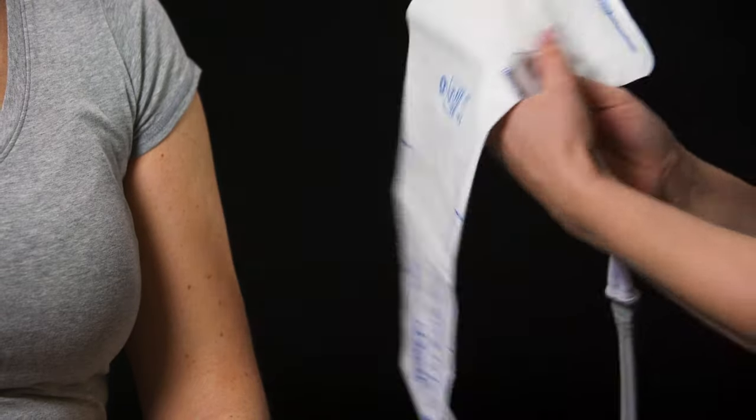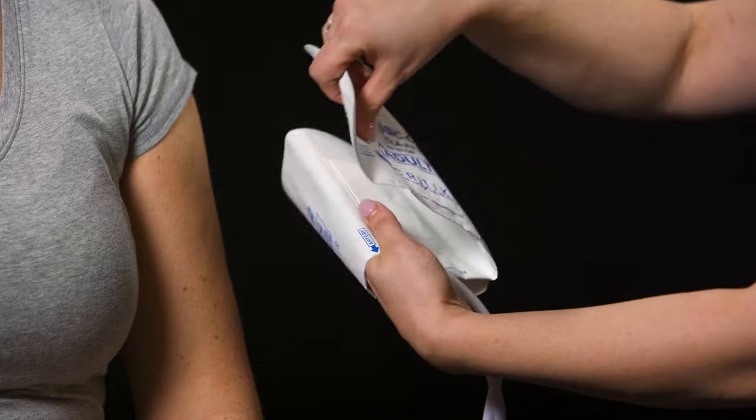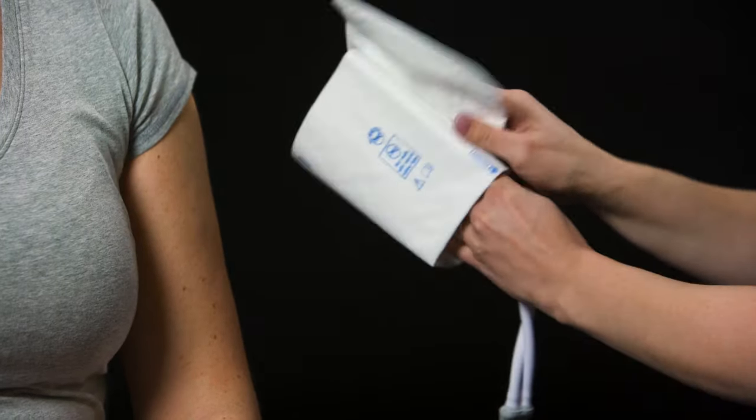Disposable Cuff Placement featuring our Classic Cuff. Before placing the Classic Cuff Blood Pressure Cuff onto your patient, ensure proper sizing is chosen. The index line should fit within the marked range on the cuff.